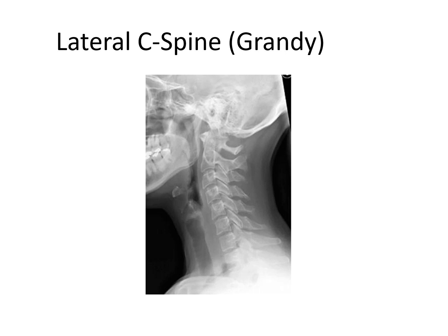All right, so let me show you the parts going from anterior. We've got, of course, the pharynx and the trachea. Immediately posterior to that, you have the vertebral bodies. So those are those cube-shaped things. Well, near the bottom, they're cube-shaped. When you get up to C1 and C2, they're kind of irregular because those are special structures. Those are the vertebral bodies, and then the black spaces in between those are intervertebral discs.